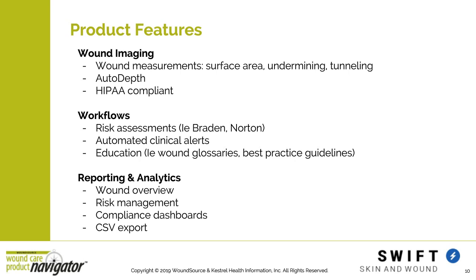We have multiple workflows: wound evaluations, as well as risk assessments. So whether it's a Braden or a Norton, whatever you use in your area of the country, we support those. We also have automated clinical alerts and education at the point of care for your nurses. So if your nurse is confused as to what the difference is between a stage 3 and stage 4, we have that information as well. And then the real-time overview for analytics and reporting. As I showed, a few different dashboards and a few different views: an overview, a risk management overview, and then a compliance dashboard, all with CSV exports as well.